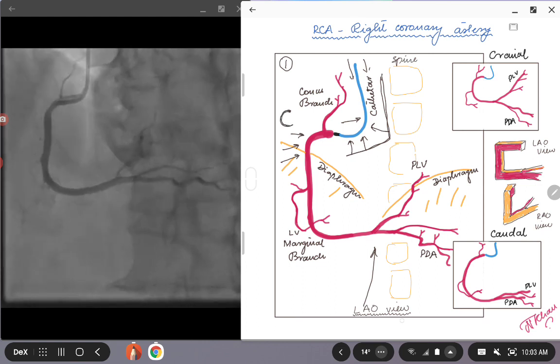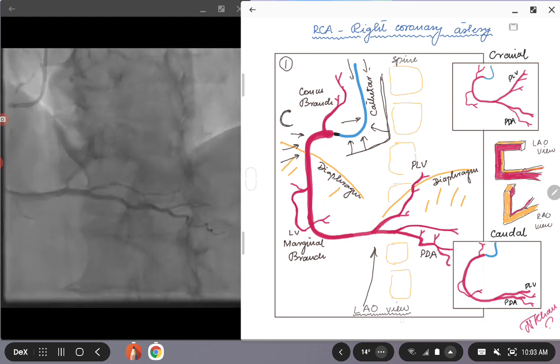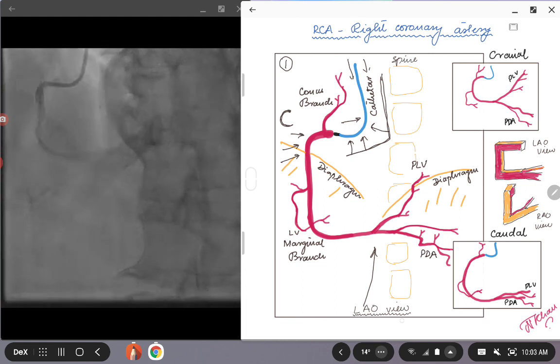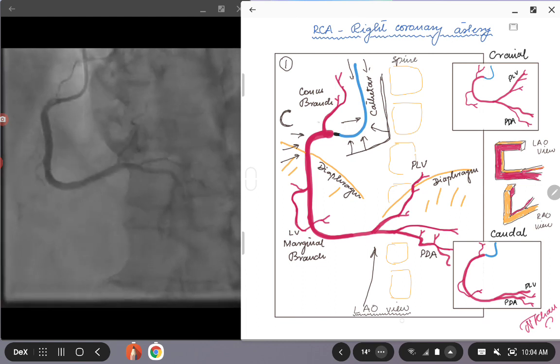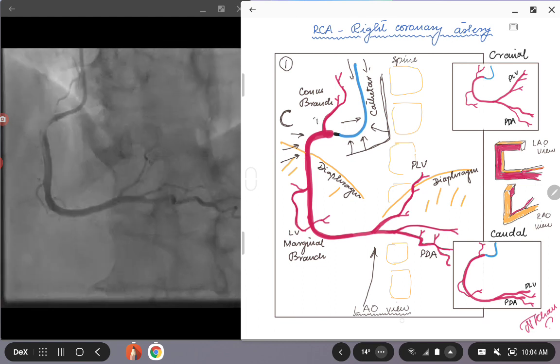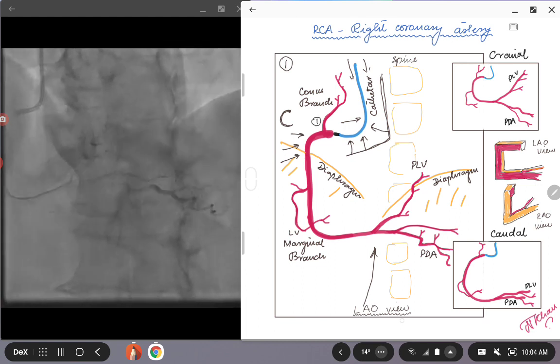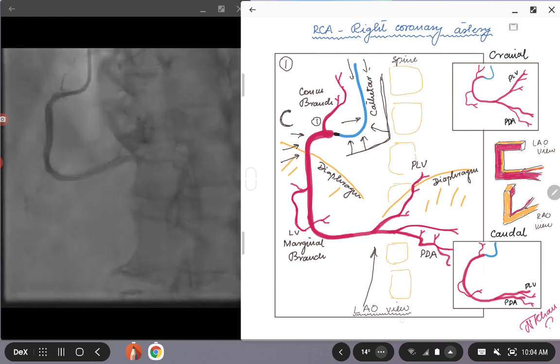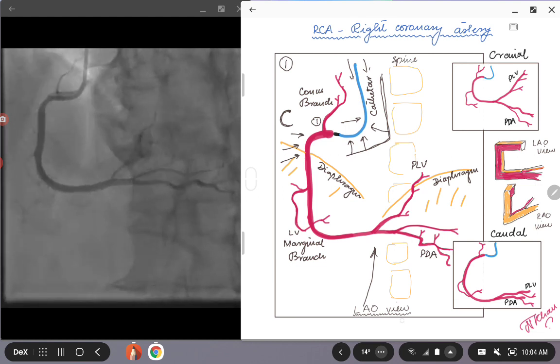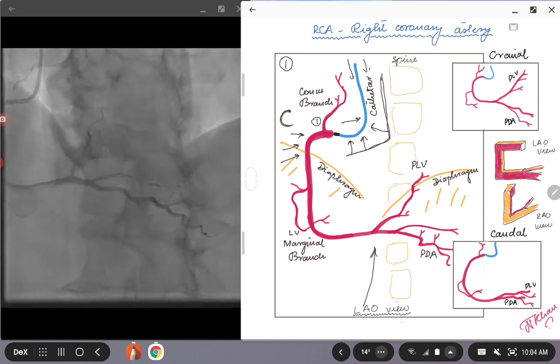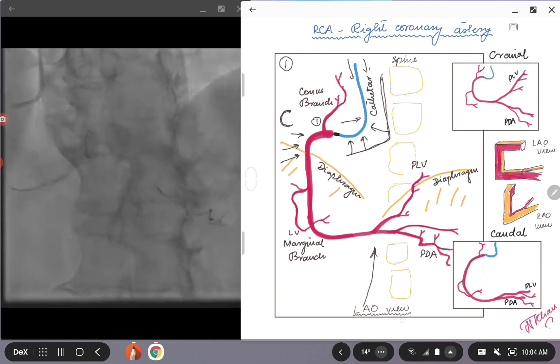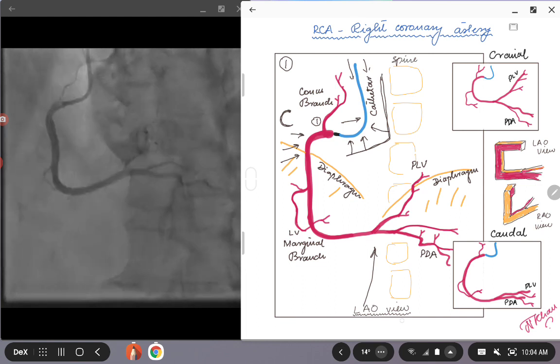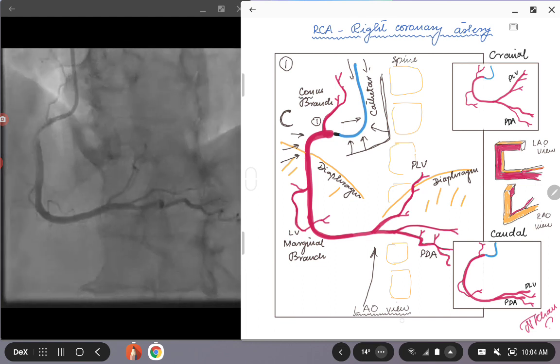It is opened up nicely. You can see the body of the right coronary artery, and the first branch that you might see coming off from the right coronary artery, probably going around like 12 o'clock or 11 o'clock position, is the conus branch.